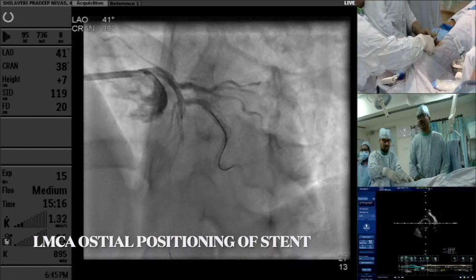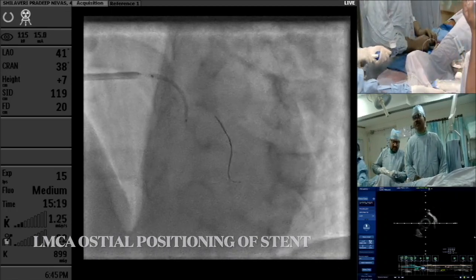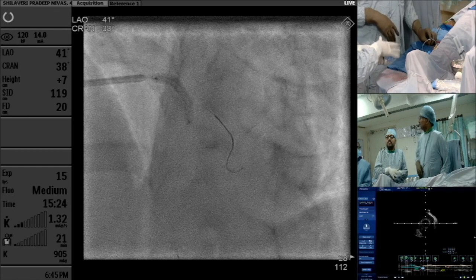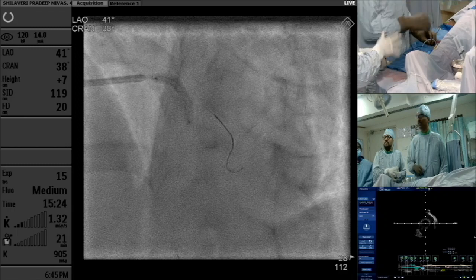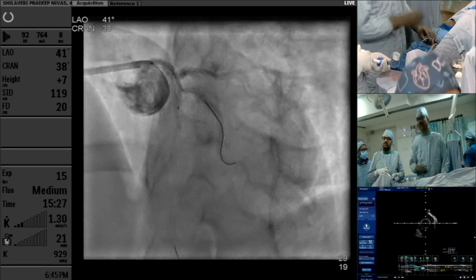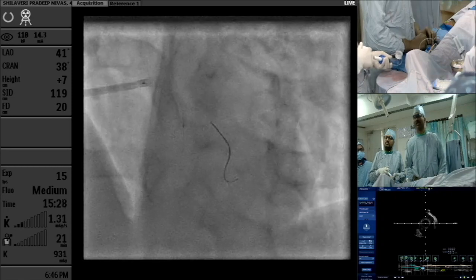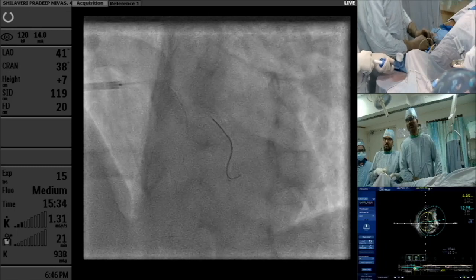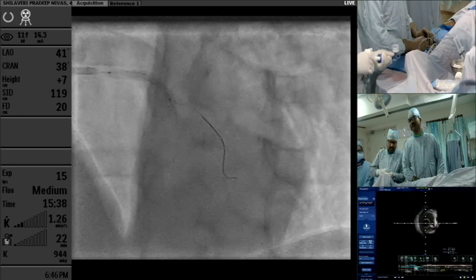See me, please. Okay, deploy. 2, 4, 6, 8, 10, 11. Yes. Negative. Someone put a feeding tube or whatever. Okay. This was not okay. So now I pull the balloon back before diagonal, so we'll go to full pressure now. Go to 14. 14, sir. Yeah. Okay, negative.